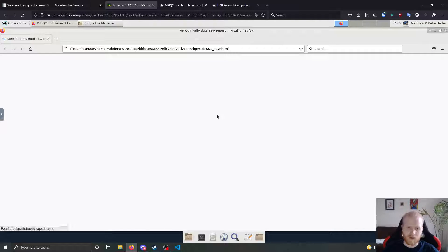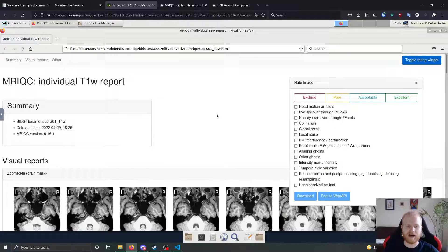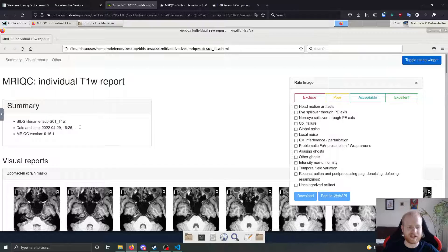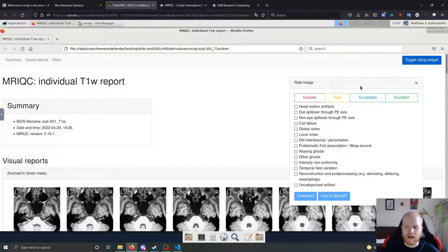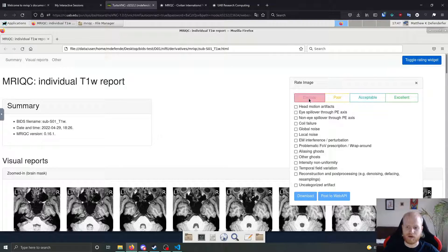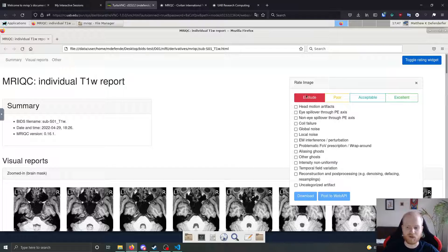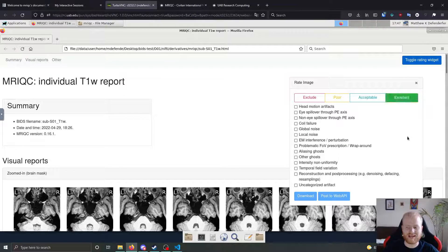So if we look at the T1 weighted image, the top of the file is going to have some pretty basic information. So the bids file name, the date and time that MRI QC was run, as well as the MRI QC version number.